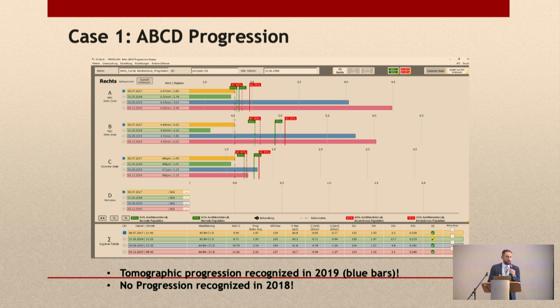But sometimes you have a case like this that you can tell the patient, well, you know what? Maybe I don't cross-link you with biomechanics because, you know, well, it's new. I don't know if I want to make a surgical decision based on that. But maybe I don't see you in a year. You know, I see you in 6 months. And then maybe you avoid seeing this tremendous progression because you wanted to see the patient in a year's time.